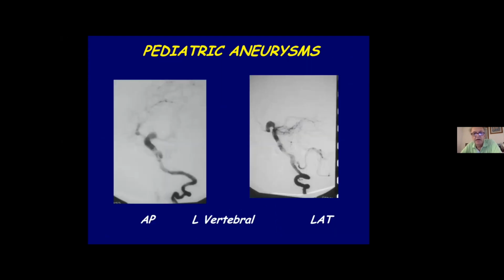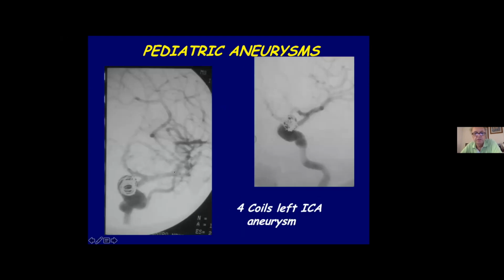And also has a dysplastic aneurysm in the posterior communicating artery. I decided to put some coil to prevent this part of the aneurysm and not touch this part. In this period, we didn't have flow diverter devices.